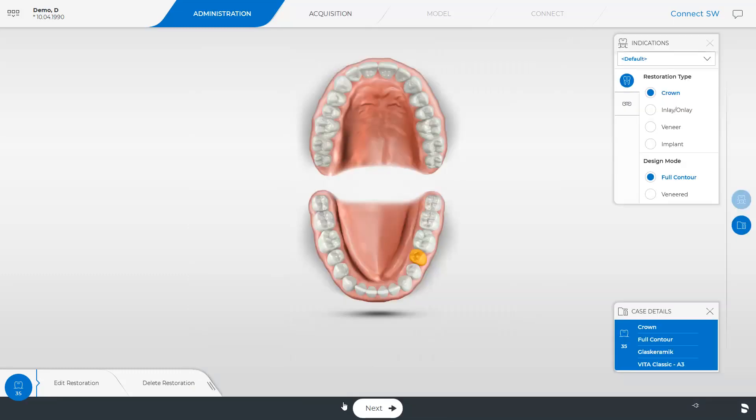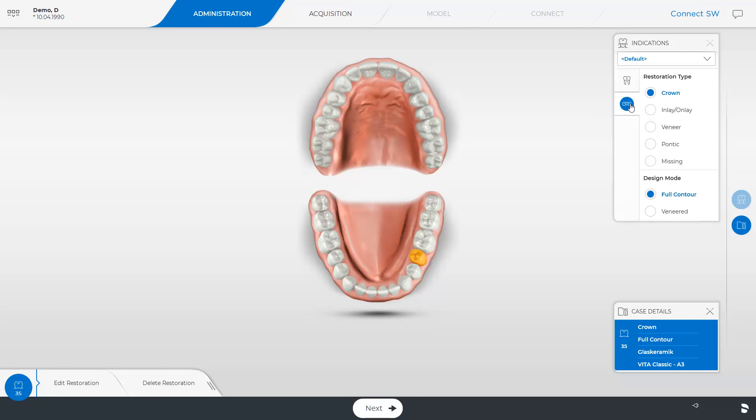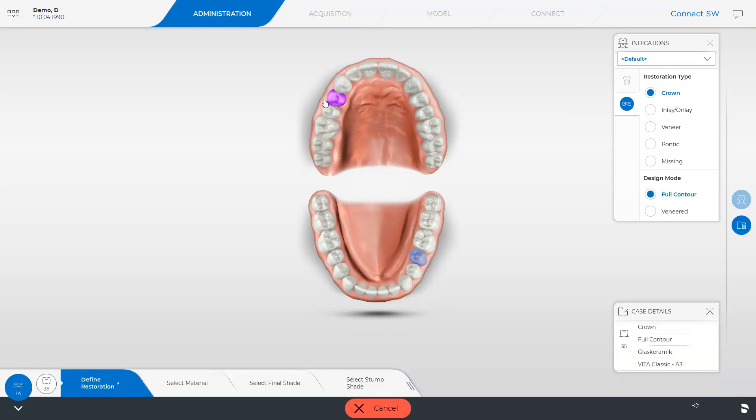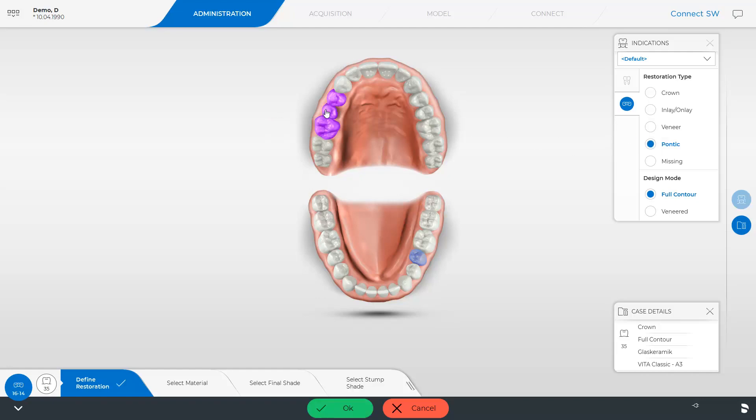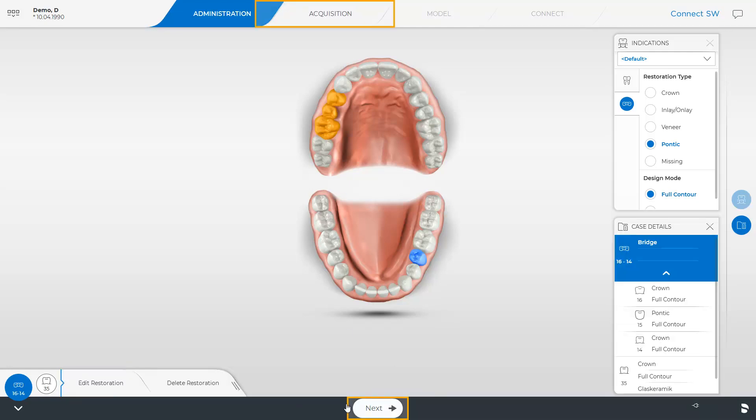For demonstration purposes only, we will create a bridge restoration in the upper jaw. To do this, we first of all select the bridge abutment and then the pontic. In this case, we skip the optional steps, confirm with OK and tap Next to continue with the acquisition phase.